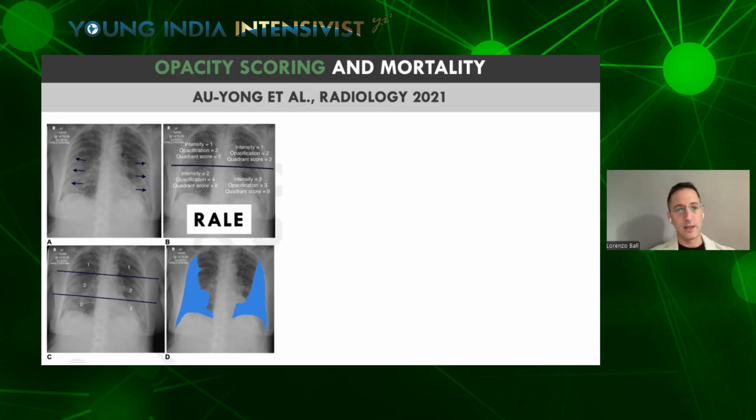It is a score based on the division in four quadrants and giving a score to the intensity of the opacification. There are other scores, such as the Brixia score. The main difference is that it divides each lung in three rather than two portions. And there are increasingly used ways of estimating the percentage of the lung occupied by opacification. These techniques are becoming available also in the bedside chest X-ray scanners that we use every day in our units.